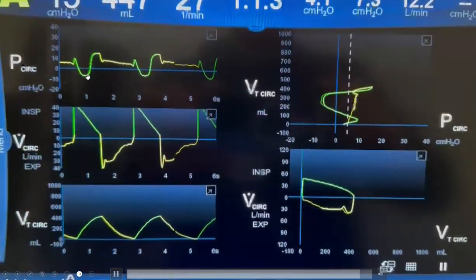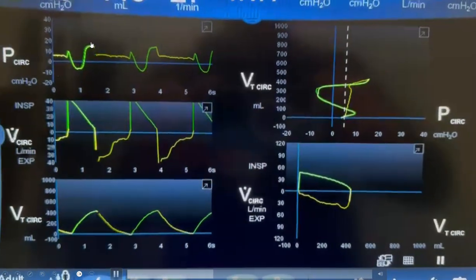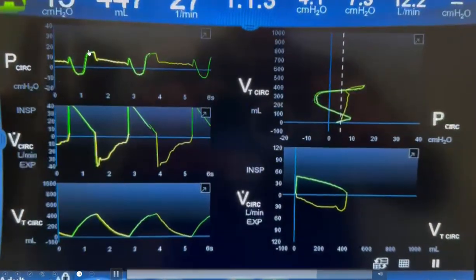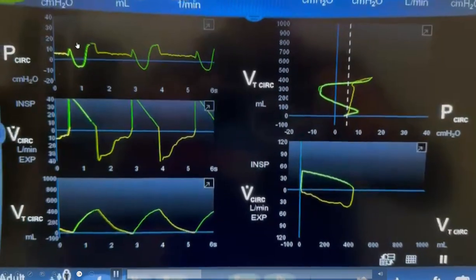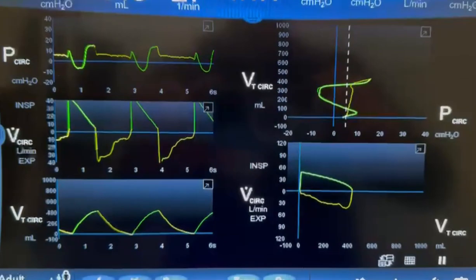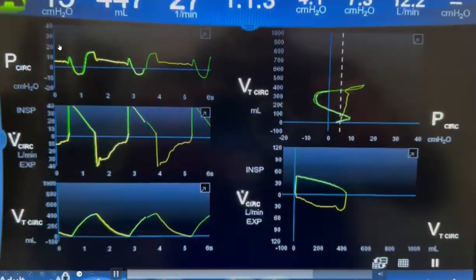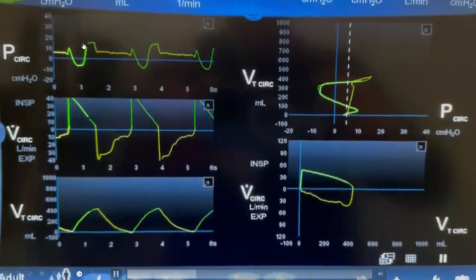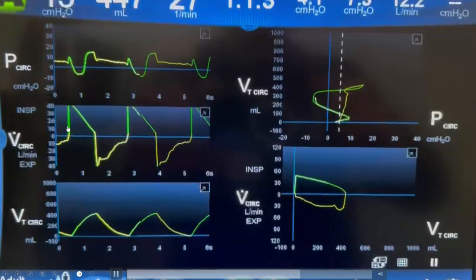At this stage here, the pressure starts to go up again and reaches around 18 to 20 centimeters of water. This drop in the pressure is caused by the patient's inspiratory efforts trying to get as much air as possible.